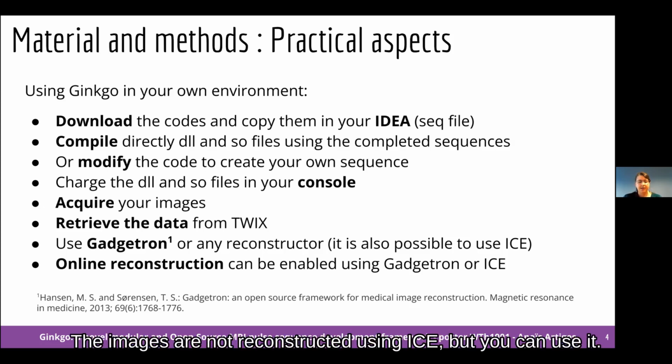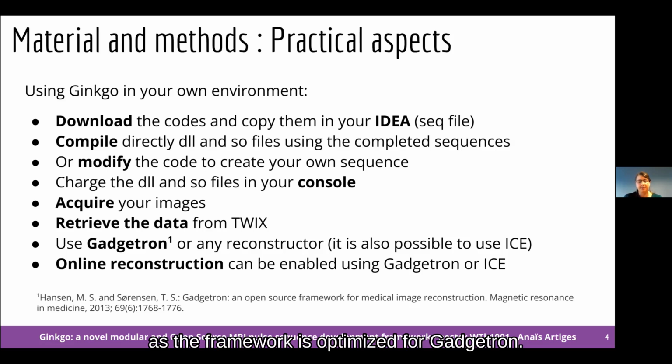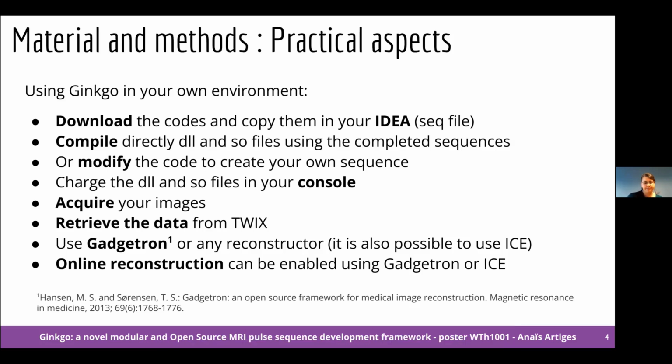The images are not reconstructed using ICE, but you can use it. But mainly, you will need to retrieve the data from Twix and use Gadgetron as a reconstructor, as the framework is optimized for Gadgetron. You must note that Gadgetron implements online reconstruction if you want to use it.